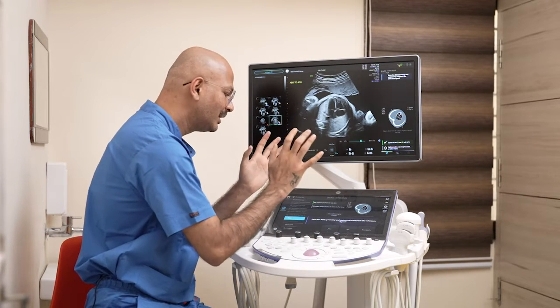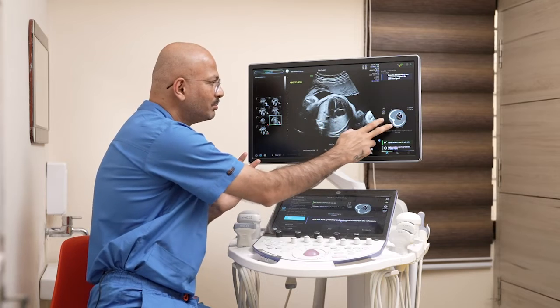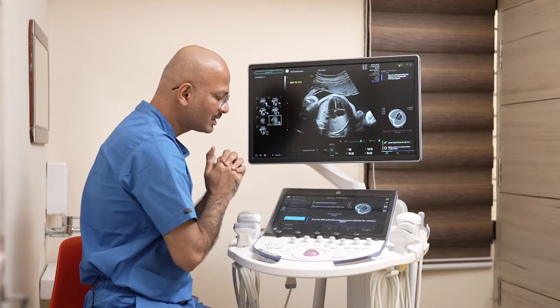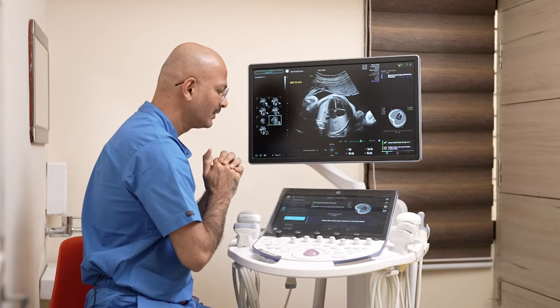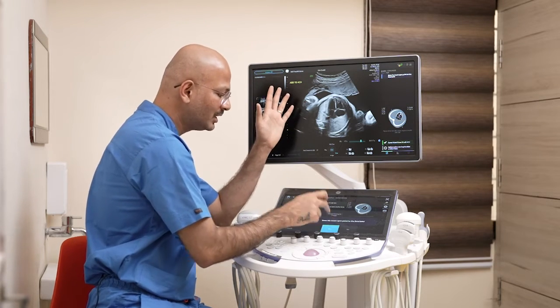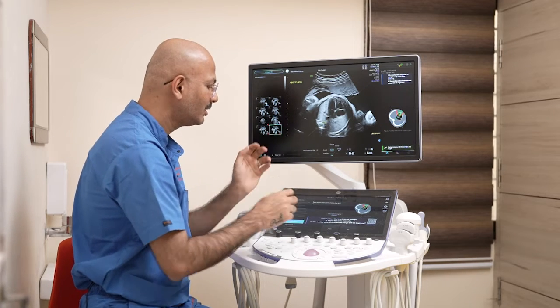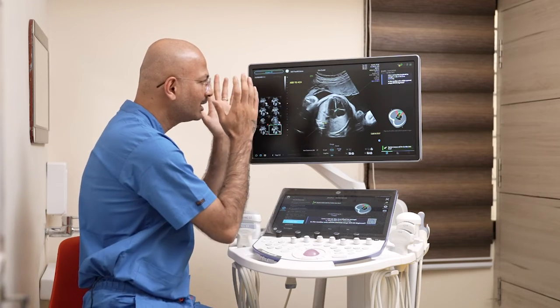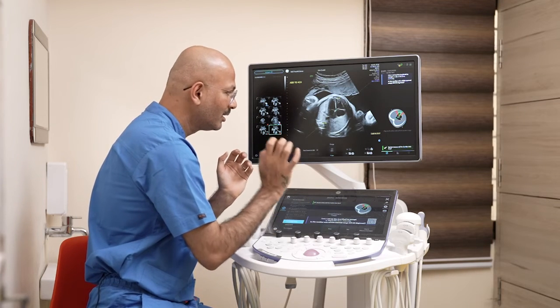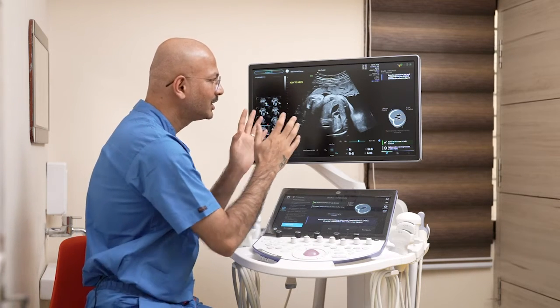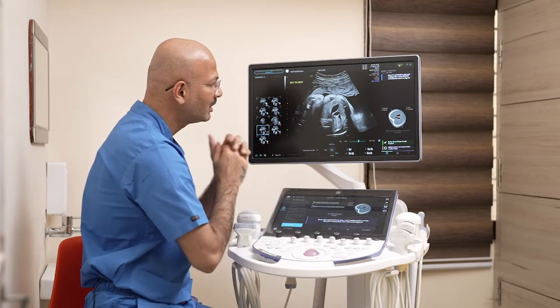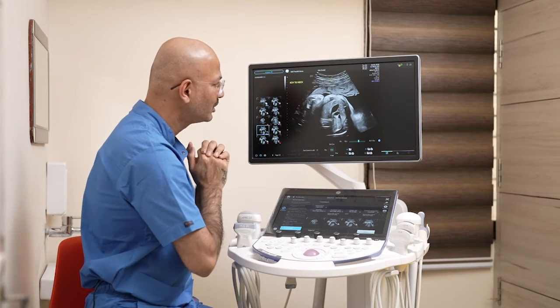Now the software is asking whether the graphical representation shown resembles your scan — yes, it is. Now the fetal heart apex is positioning to the left — yes. It has already mentioned the cardiac axis, and it is asking for resemblance with the graphical picture. Yes, it is very resembling, so I'm putting yes.